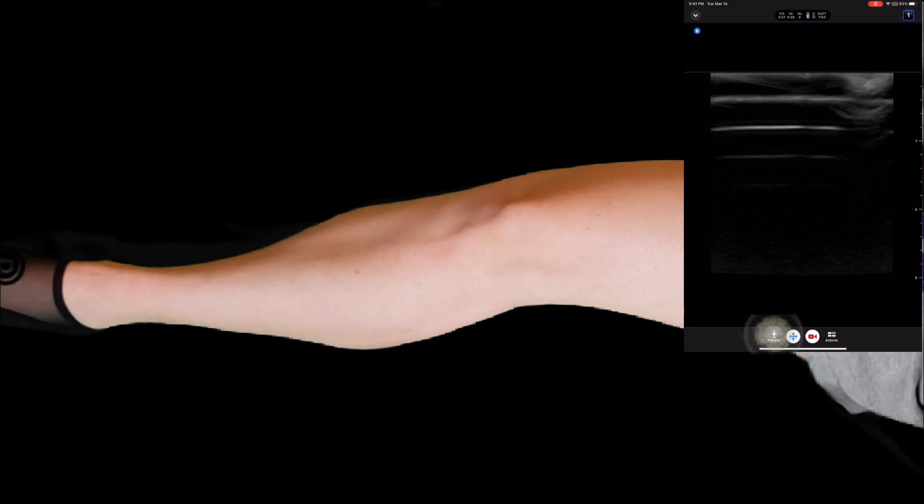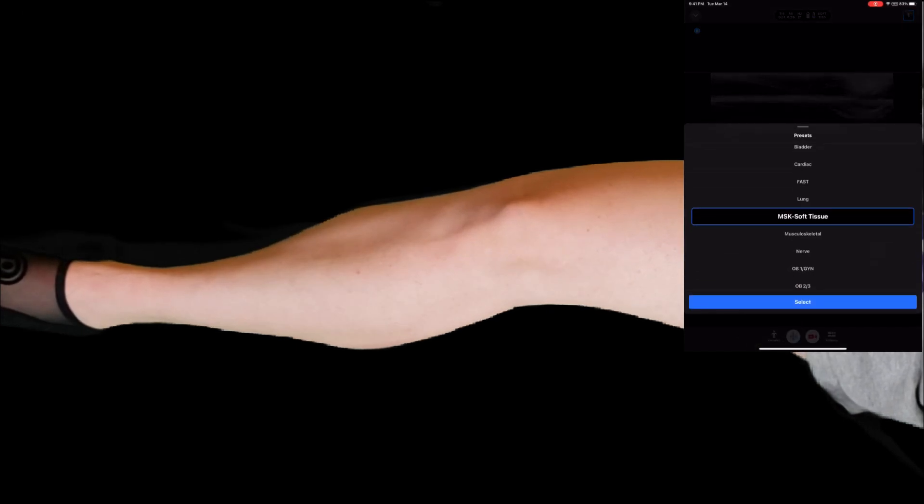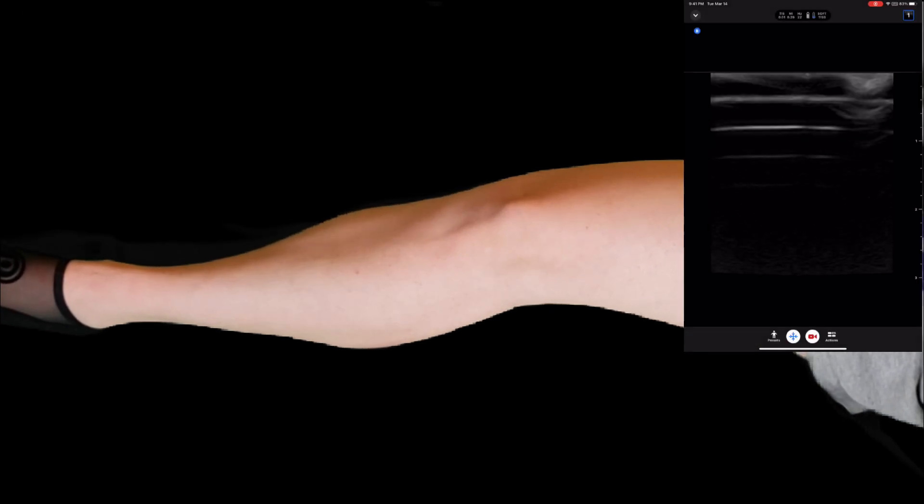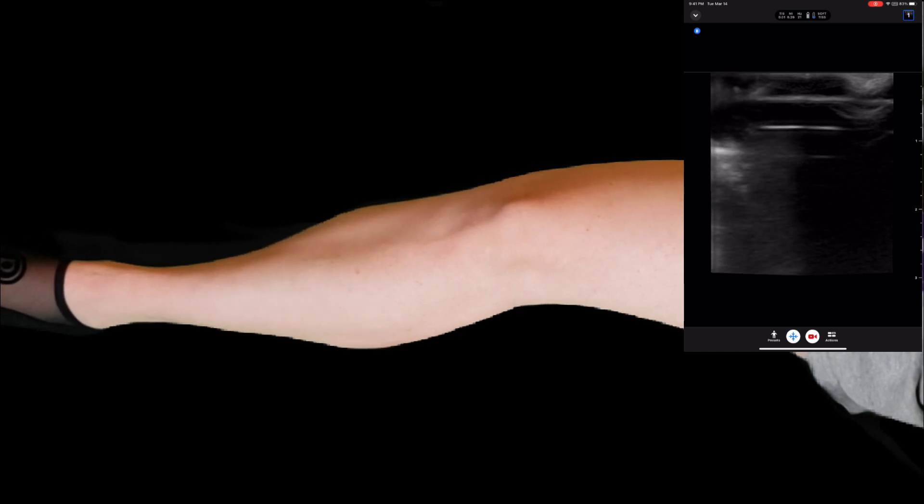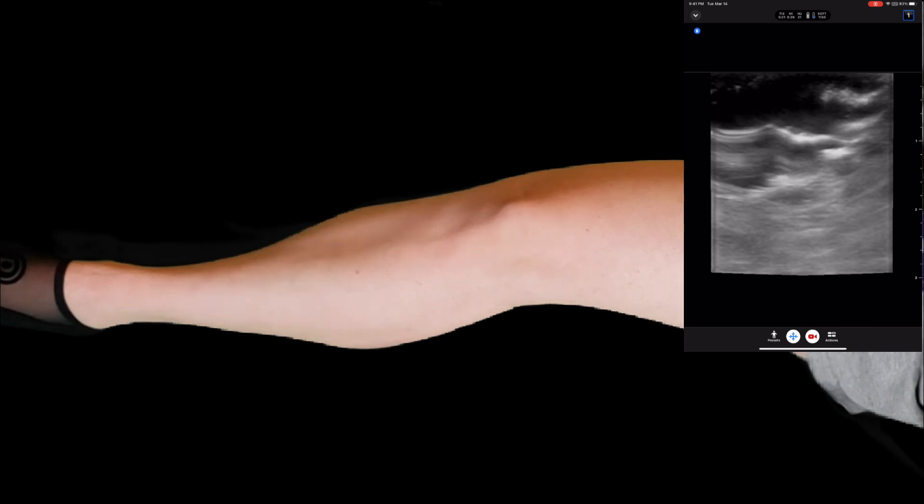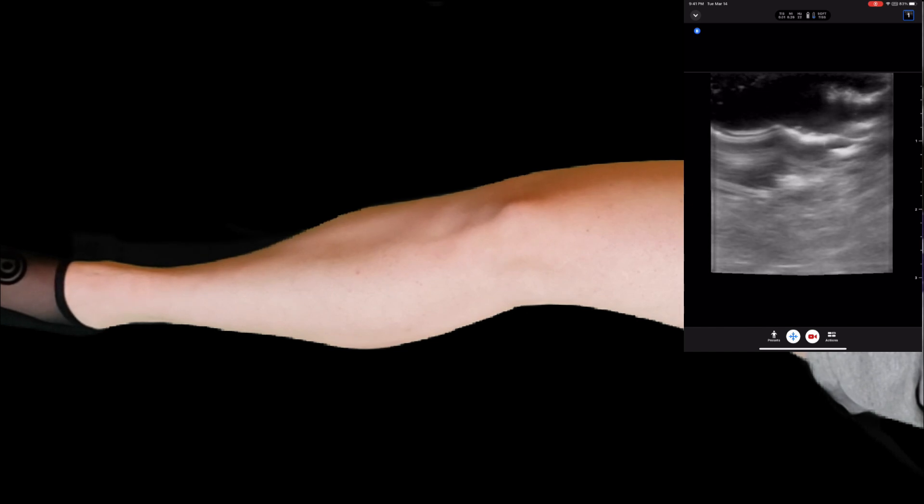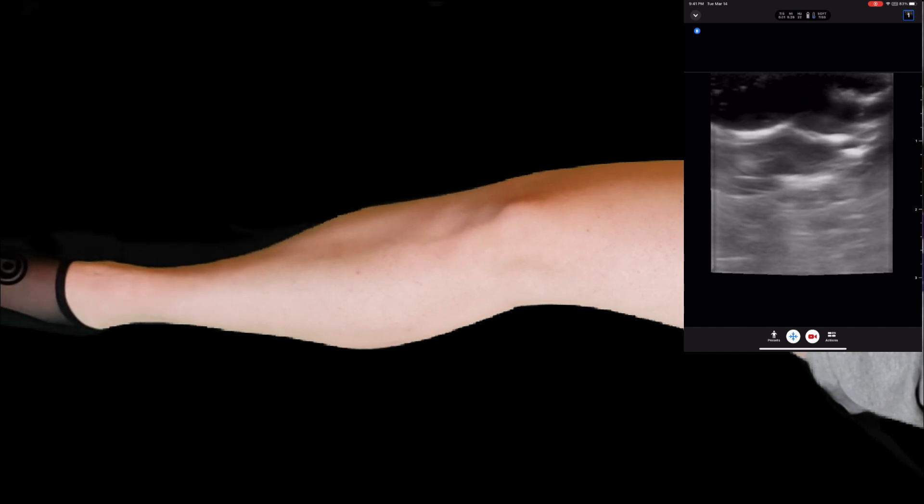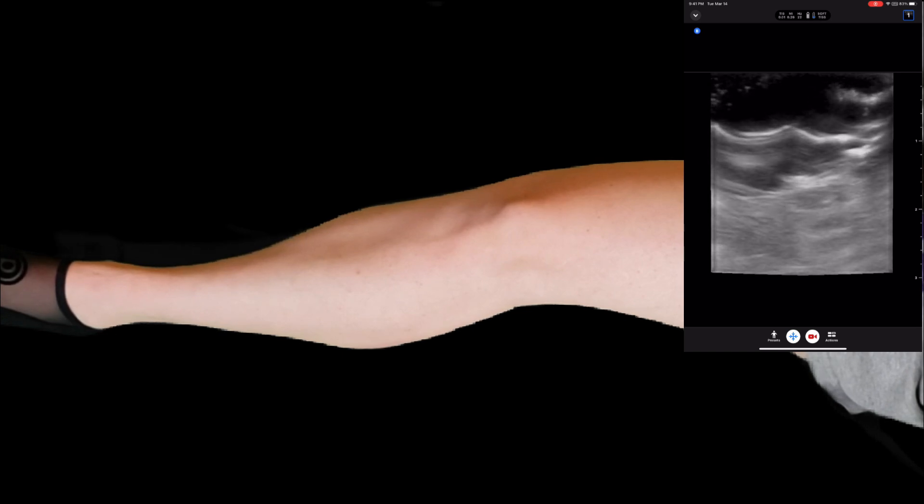For this exam, we'll want to choose the musculoskeletal or soft tissue preset. The marker dot will be pointed towards the patient's head, and we will look at the knee in a sagittal view.